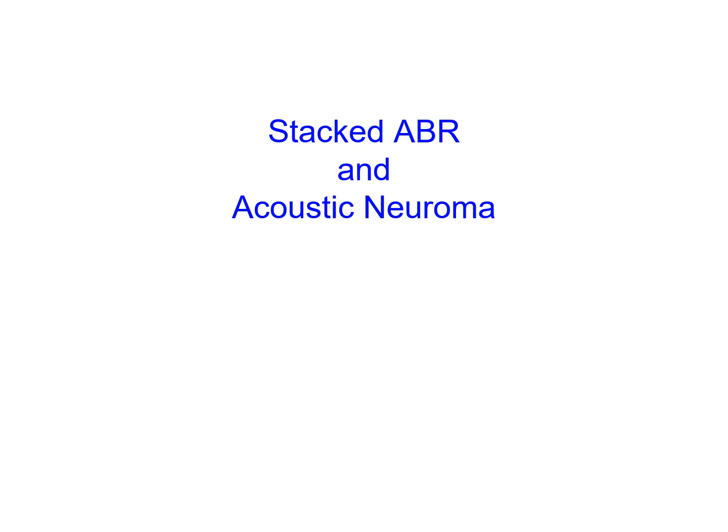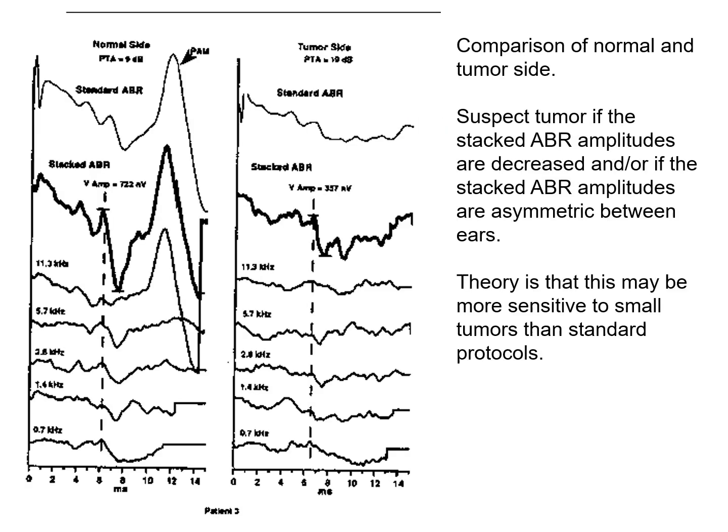Stacked ABR can be used to help diagnose acoustic neuroma and some other tumors, especially when the tumor is small in size. This slide shows how to use stacked ABR to help identify a tumor, for example.